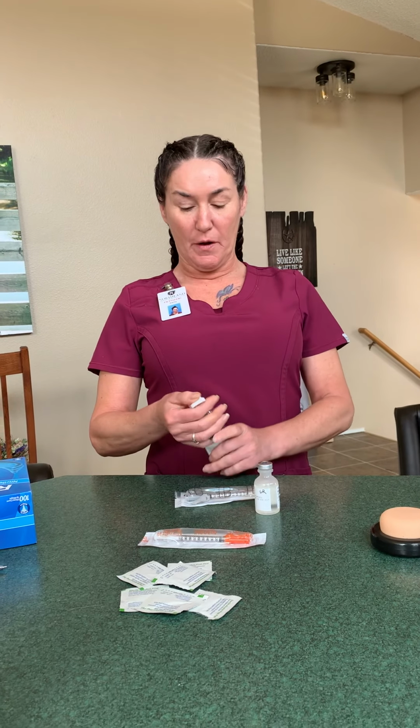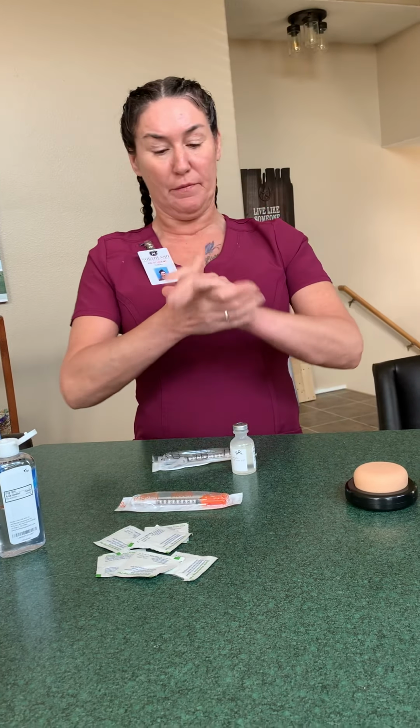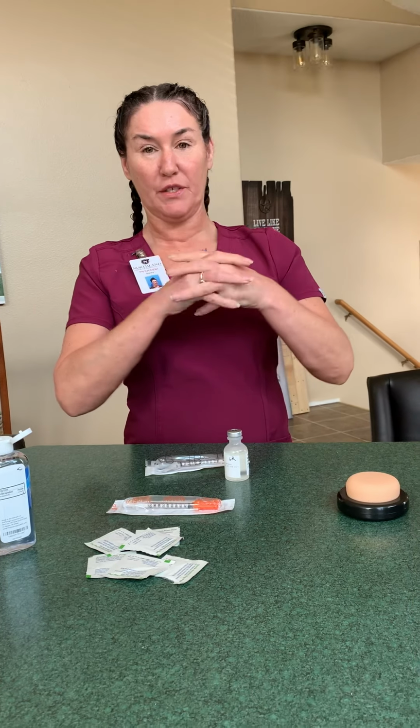Hi, my name is Stacy, and today we'll be preparing and administering two different shots: an insulin shot and one for a TB or tuberculin shot. We're going to start with our TB.